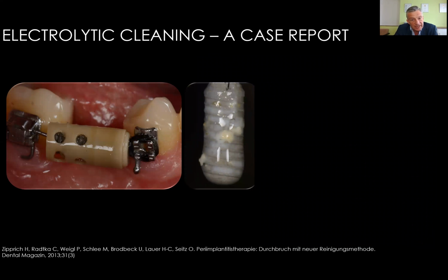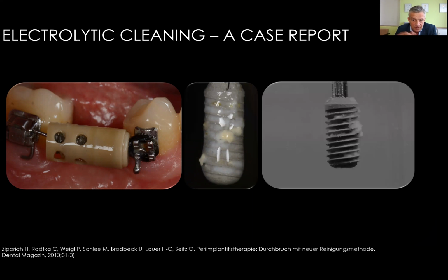Now I'd like to share some studies and investigations we did on the method. These were the first trials. We had some implants which we put into the mouth of some persons who agreed to take part in this study. The implants were protected by this plastic shield. We didn't want to have epithelium from the oral cavity on the implant, and we waited for a certain period of time until a mature biofilm grew on the implant surface.